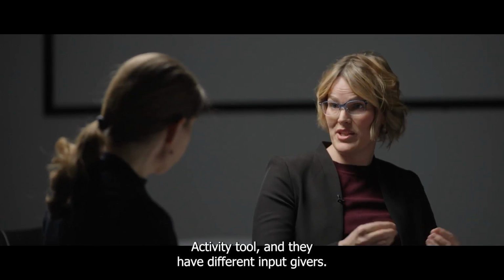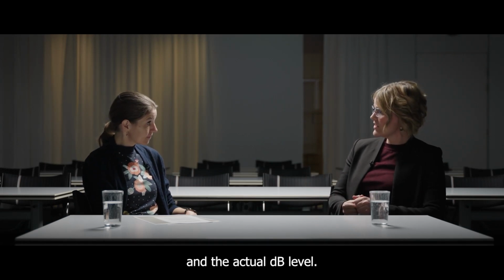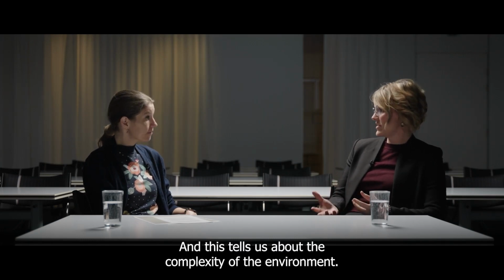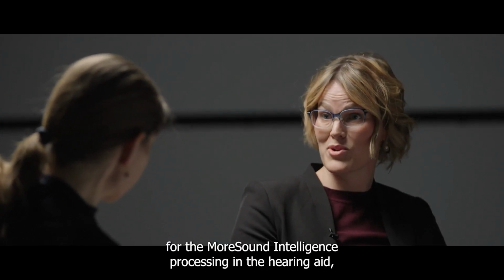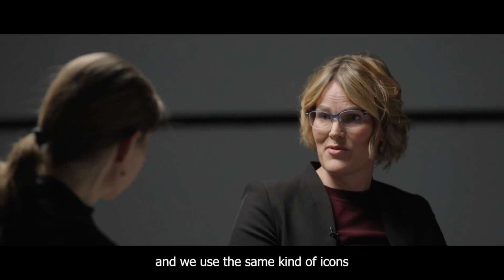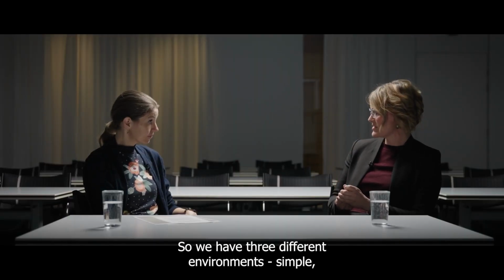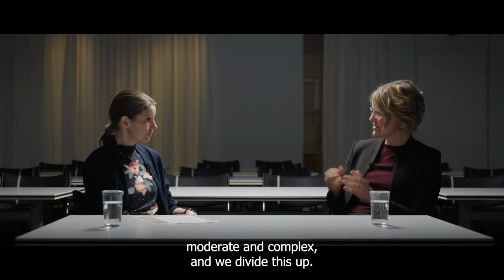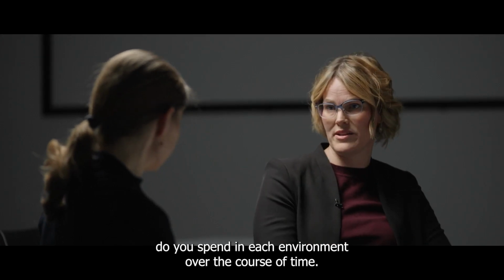And they have different input givers. So in the environments tool, we get information from the SNR level and the actual dB level. And this tells us about the complexity of the environment. And we actually use the same detectors we would use for the more sound intelligence processing in the hearing aid. And we use the same kind of icons and way of talking about it as we do when we talk about more sound intelligence. So we have three different environments: simple, moderate, and complex. And we divide this up: how much time do you spend in each environment over the course of time?